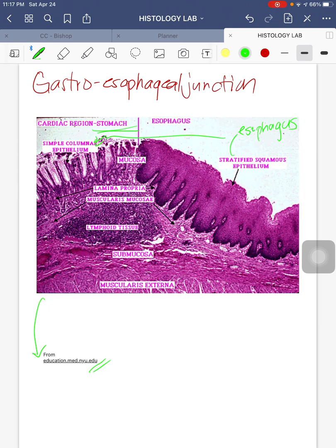You still see all the layers, the mucosa layer, which changes again the lining epithelium, lamina propria supporting connective tissue below, and the muscularis mucosae that could also contain lymphoid nodules. Okay, and one layer muscularis mucosae. So this will comprise this area. So I'll just put here. This comprises again your tunica mucosa. The submucosa layer is already below. Okay, and finally your muscularis externa.